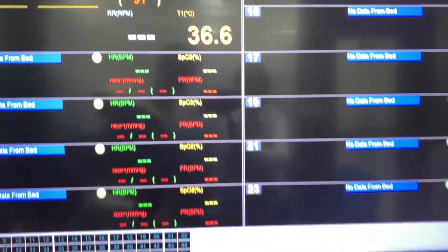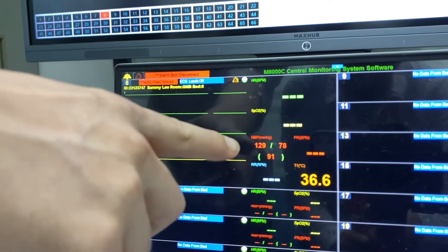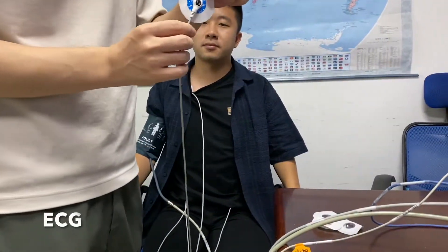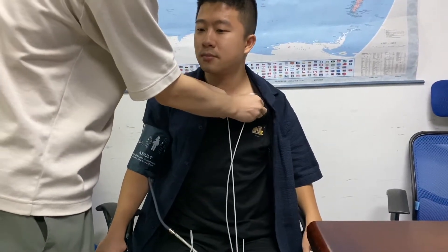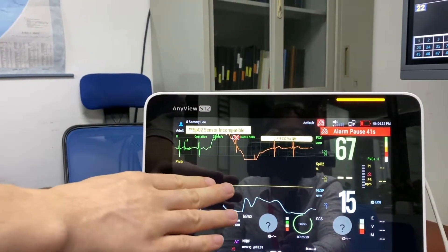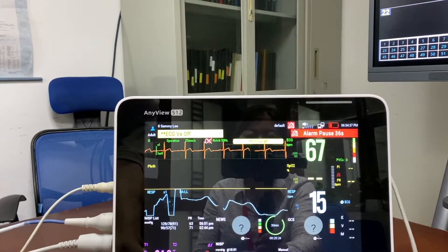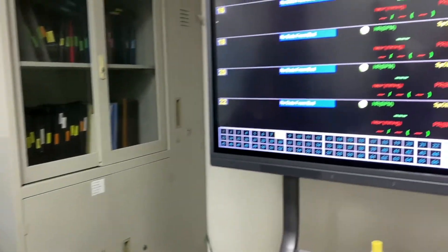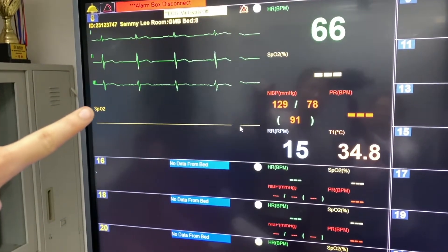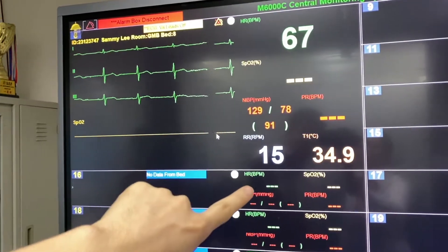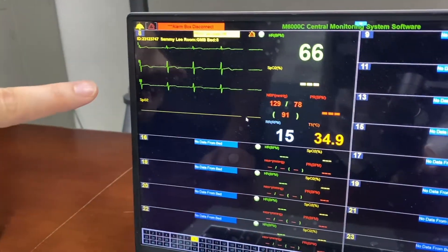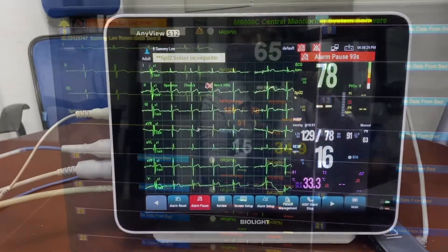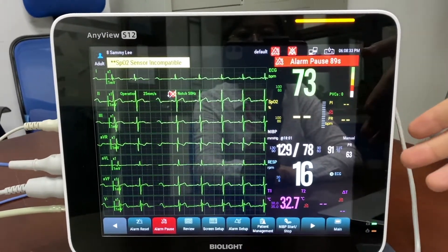This is the ECG probe which we apply to the patient's chest. Once we finish pasting the leads, we will be able to see the patient's ECG waveform on the S-series patient monitor. On the CMS you will also be able to see the ECG waveforms in real time, together with respiration — the respiration is 15 breaths per minute — on the external display as well. Seven leads can be displayed on the screen together, and also in the CMS.